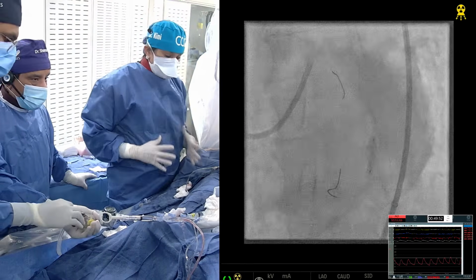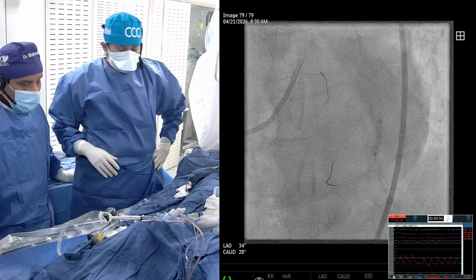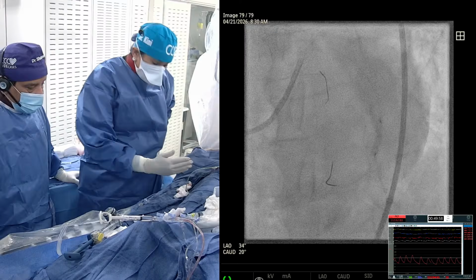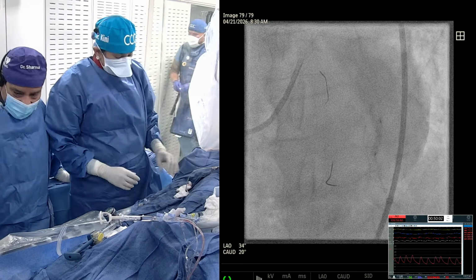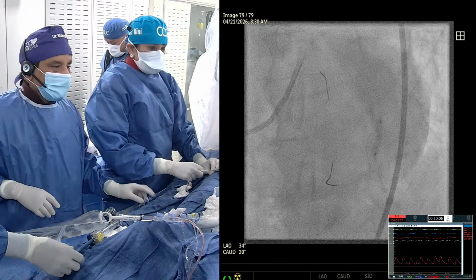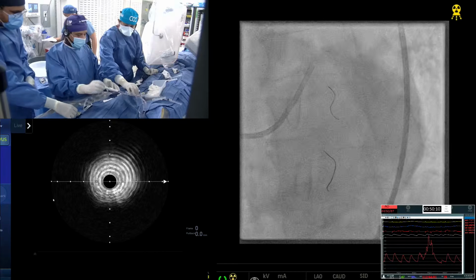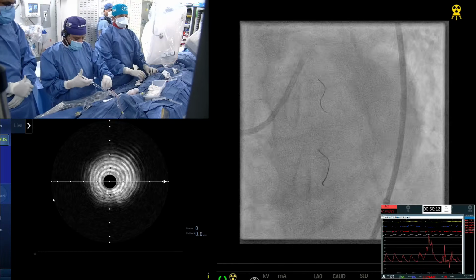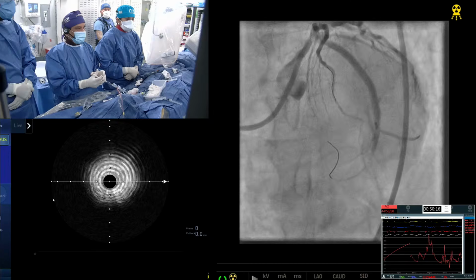Key is very particular that if we are going to do an IVUS-guided procedure and PCI, we need to do imaging maybe in between and post. That's why I don't want to dilate it and not have the right imaging analysis. You have the slide that we need to do pre-assessment, assessment in between, and after the device.